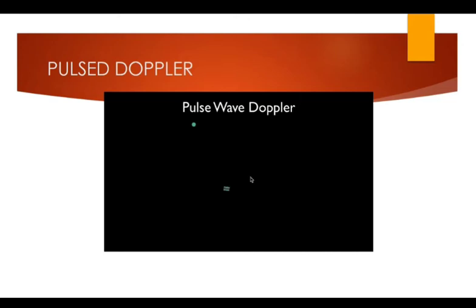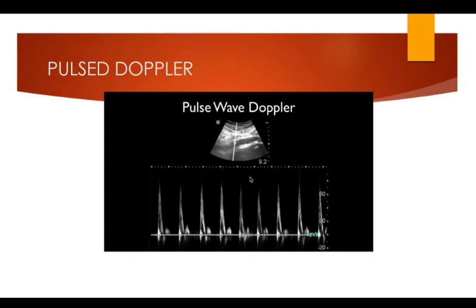And so we are going to get a sample that looks like this. At time 0, it gives you a tracing going from left to right of what's happening over time. And we get it in a scale of centimeters per second. So if we look at this aorta, we're getting flows approaching about 75 to 80 up here. It gets a little light there, but you can tell it's coming up all the way to the top. And that's how fast that flow is coming across.